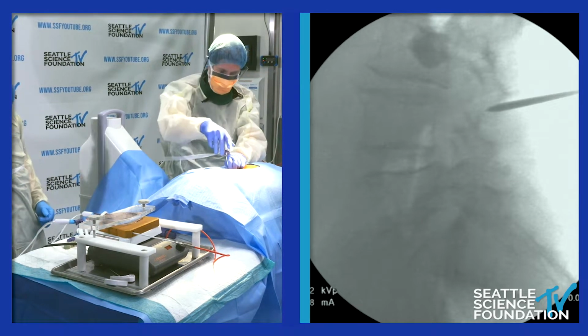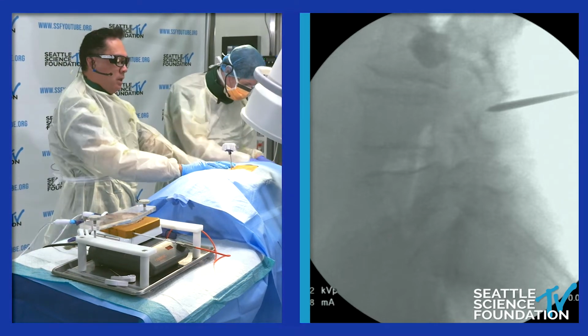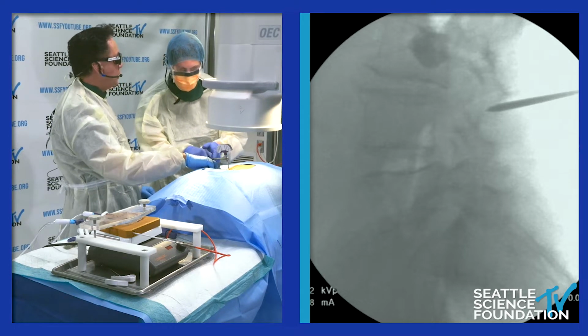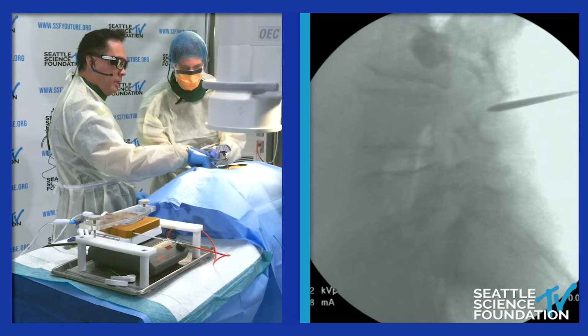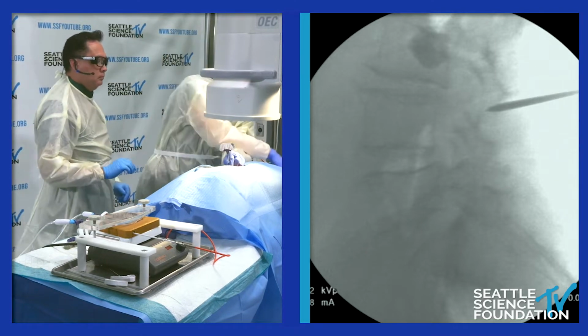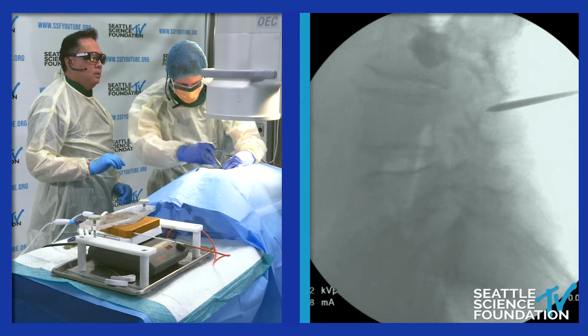Let's go back to AP. That's why I usually approach it from anywhere 2 inches lateral and 2 inches superior to where we're going to access the pedicle. So here, go even further out. Let me reposition that entirely.